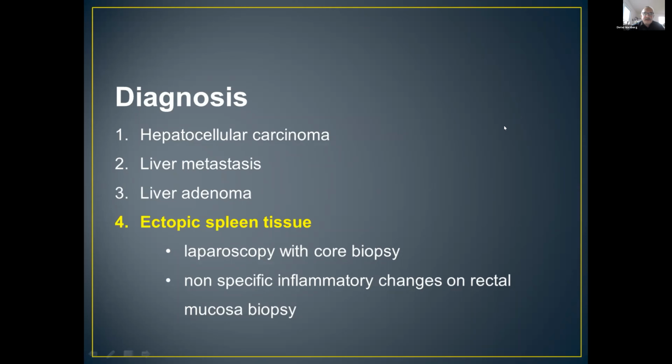Do you think we can only use contrast media ultrasound to say, because of the long time enhancement, that it is an accessory spleen? Is it enough? We don't need another imaging method today? I think yes. Okay. Next case.